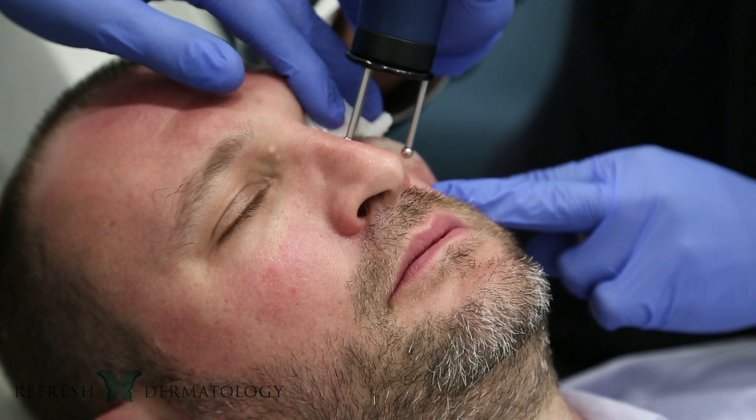There are no needles involved — it's really all just light-based, super easy, super tolerable procedure.